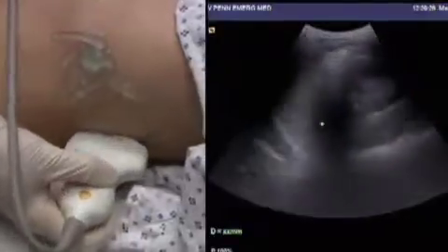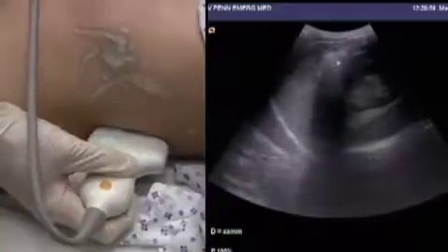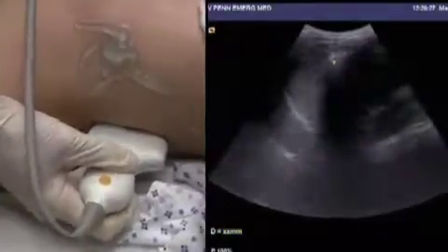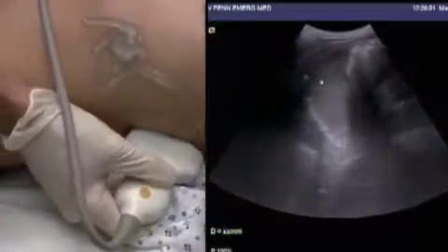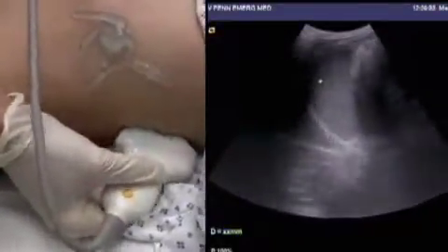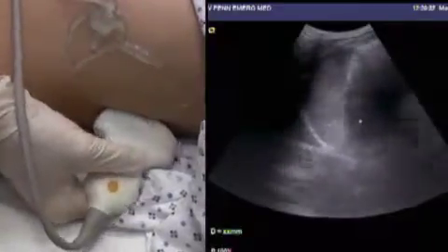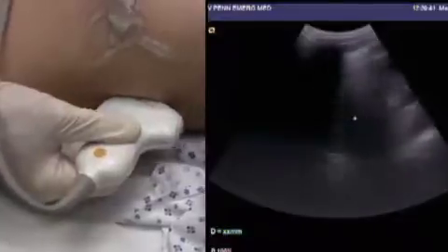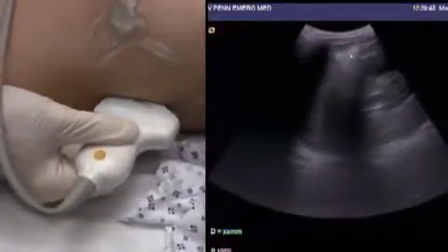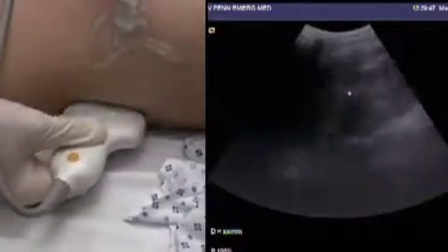We move down a rib space and get an image of some of the kidney and a rib space — actually probably a piece of air-filled bowel completely overlying the splenorenal space, which is inconvenient. Maybe we can just get a sense of the splenorenal space back here, or by moving down a little bit. But in general, this exam is slightly limited because of the presence of this gas overlying the key space that we want to analyze.